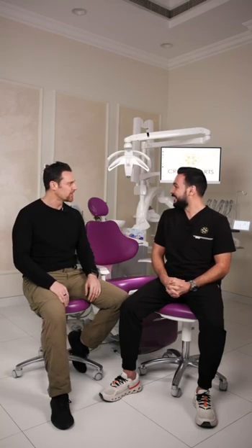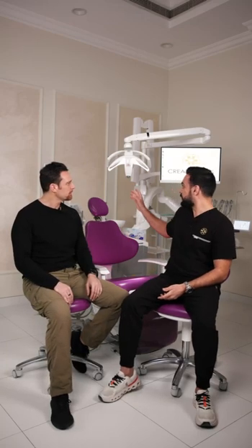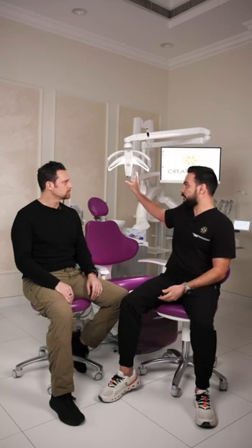How do patients feel during the treatments? Do they understand they have the camera, or not? Because sometimes they don't even know that they have a camera in front of them. That's a very good question. So it looks like a light. No one knows that there's a camera.